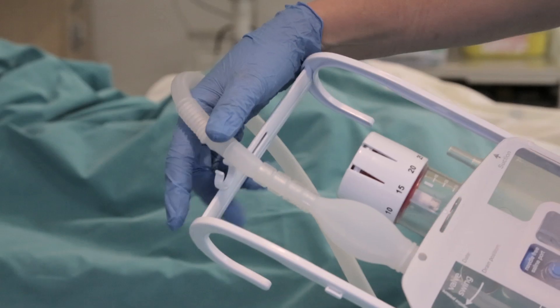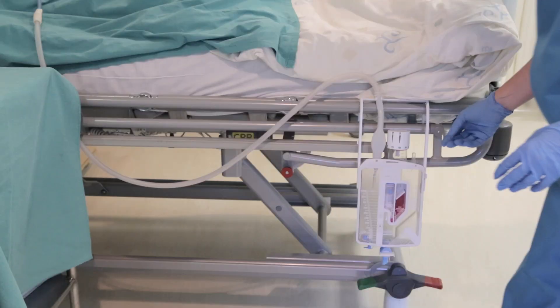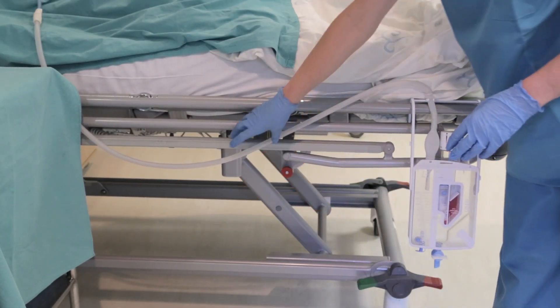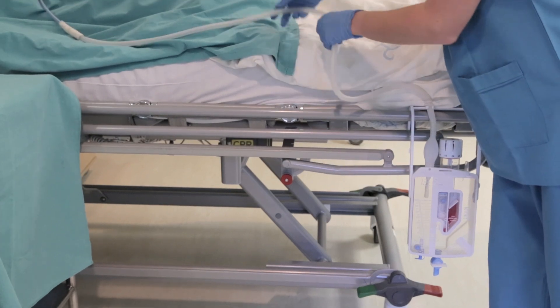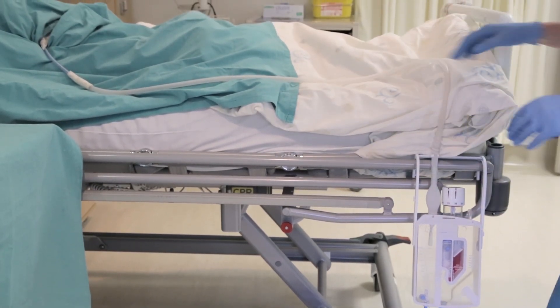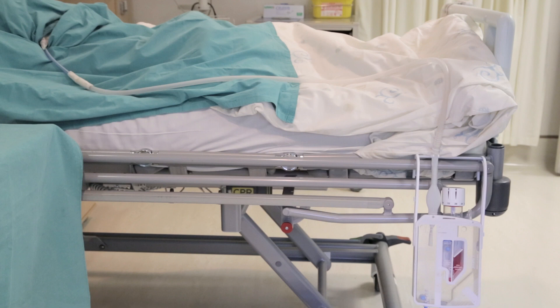Hang the device next to the bed, lower than the patient. Ensure that there are no dependent loops or kinks in the patient drainage tubing where fluid can accumulate. The short tubing of the Synapi chest drain reduces the probability of this occurrence.